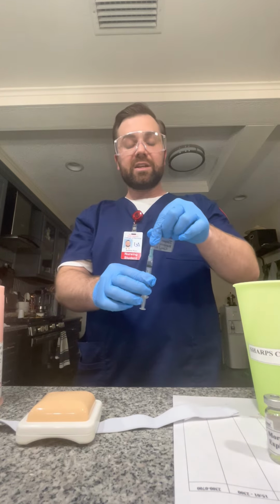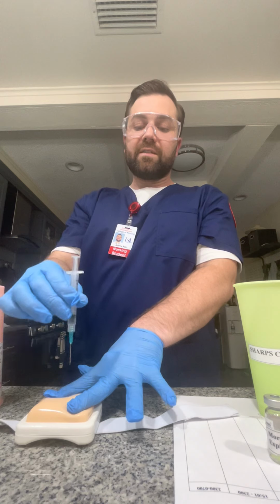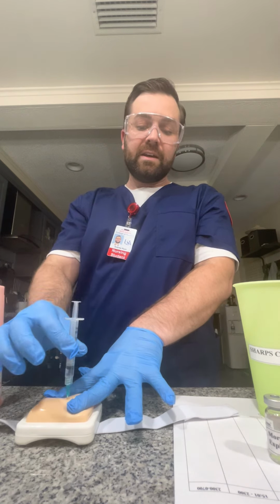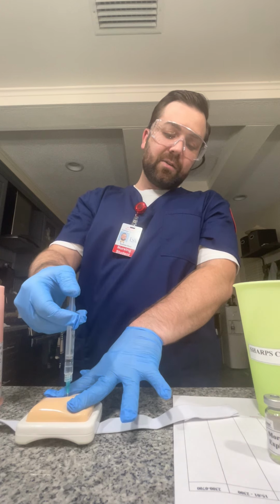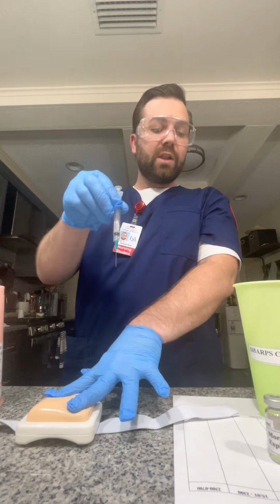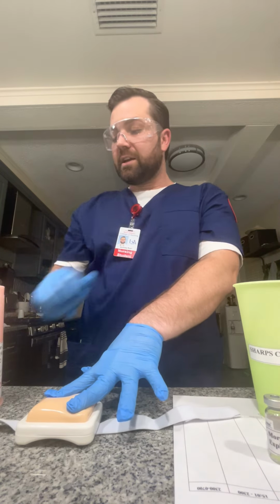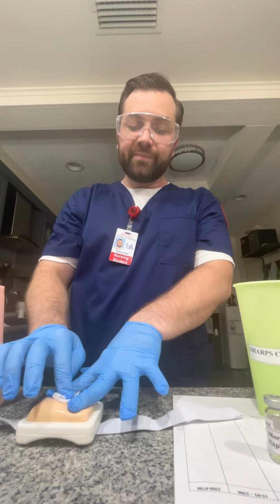I'm going to spread your skin. All right, you're going to feel a quick prick. All right, I'm going to aspirate. I do not see any blood, so I'm going to slowly inject and quickly pull out. This will be going in my sharps container, and I'll get a new alcohol pad, and I will just quickly place that on your skin.